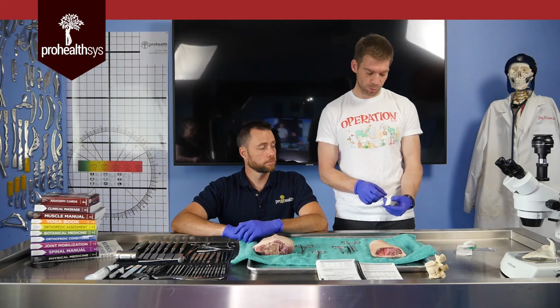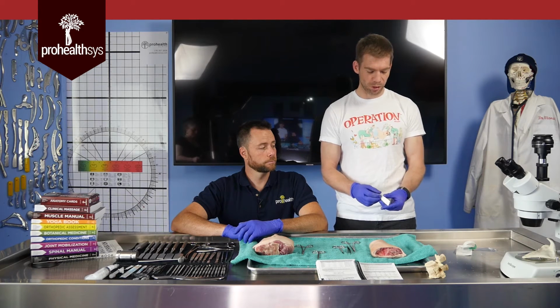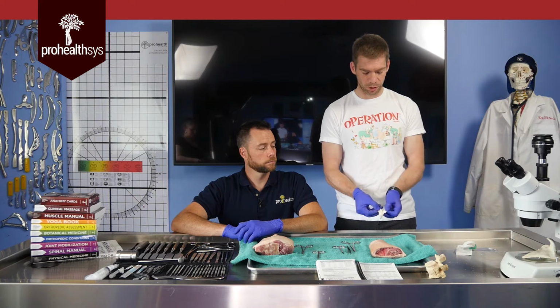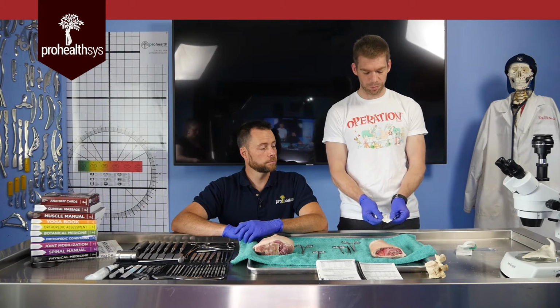It says fold corner back, so you can take this corner here and fold it back. It's got a little tab there. I always find it hard to do with gloves though, so I don't mind folding this corner just like this. If you open it like a book, you're going to be safe, because as you open it, there you go. There's the needle, and your fingers are away from it.